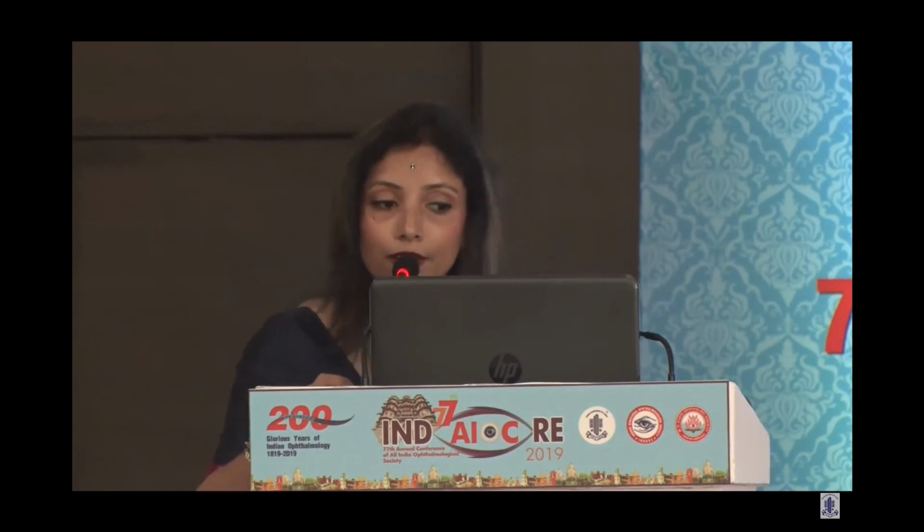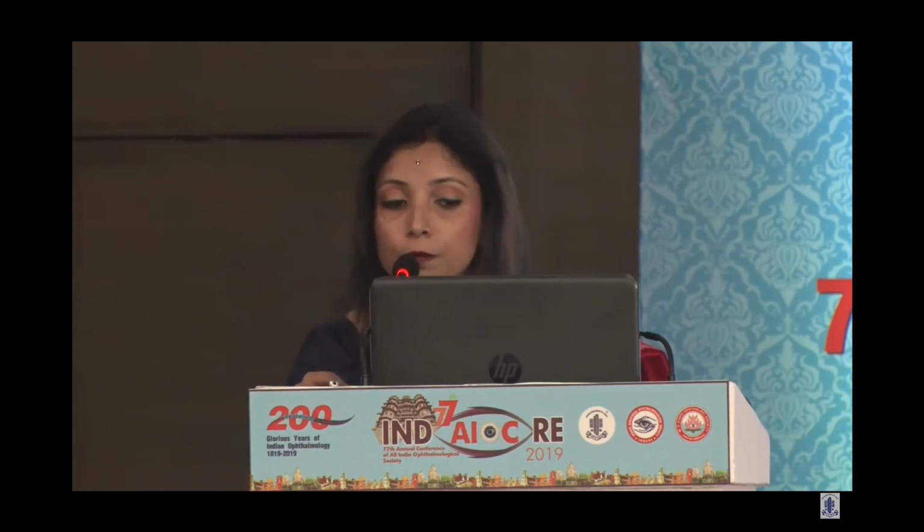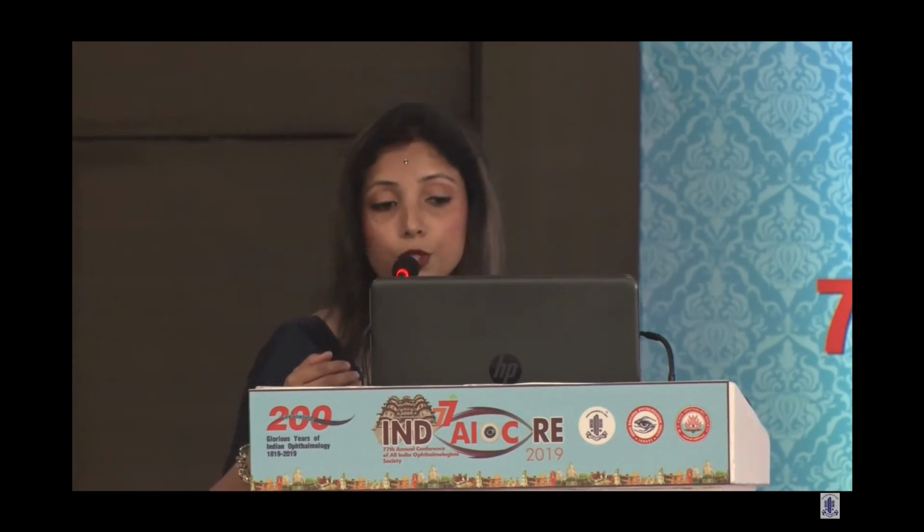Coming to the sterilization part, which is the most important. Now coming to the operation room and corridor cleaning. No dry dusting, as has already been mentioned. Wet mopping with Bacillocid and formalin fumigation, though it is not preferred by the CDC, but still many of the OTs are still continuing with the formalin fumigation.